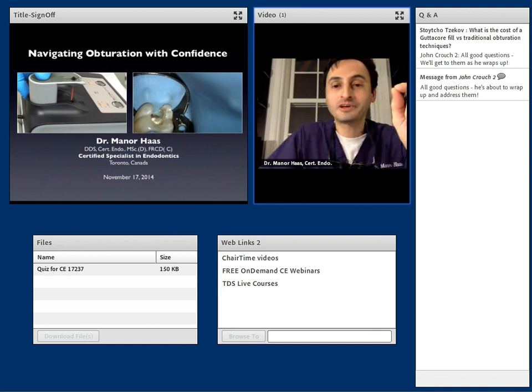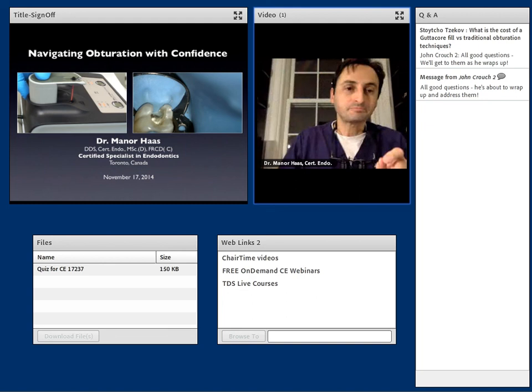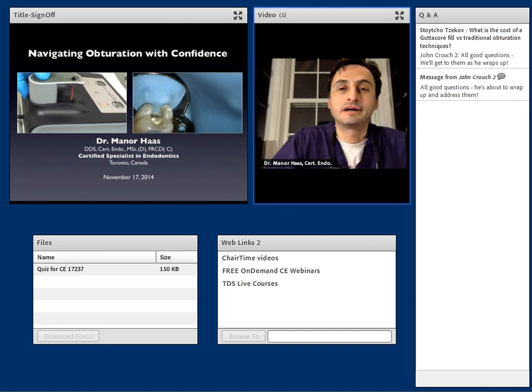Noel touched on the access walls. When you're putting in your access, believe it or not, if you just barely nick the access wall, it's really not the end. I would still go ahead and obturate. I wouldn't even bother going into the canal. This will be an issue more the first one or two times. You'll just handle it like it is a paper point. Nothing more you do.